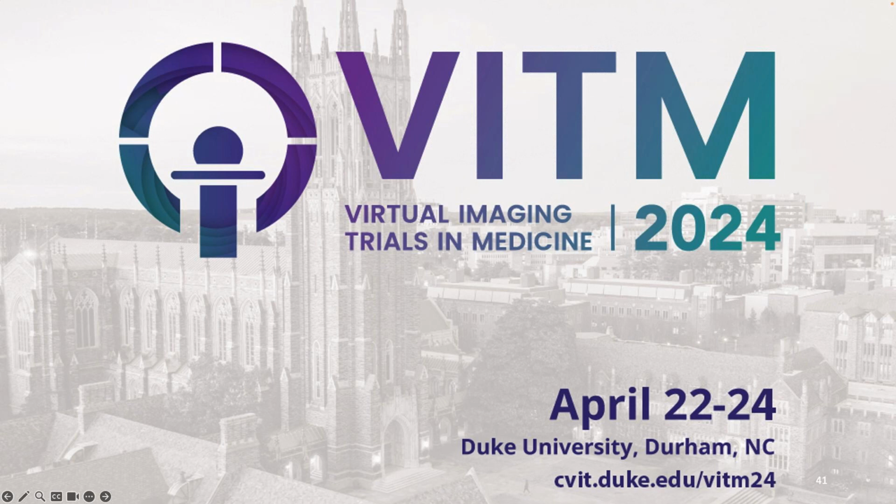Yeah, so we do collaborate with CT vendors, and we work with them often. I can say that there is huge interest because they see various utility in it. From a design perspective, it's very helpful for vendors to have these trials, because before creating the hardware, they can test a few things. Let's say they want to design new detector models. The old-school way of doing it is to design some hardware with different materials and options, and then image them and see which one is better.